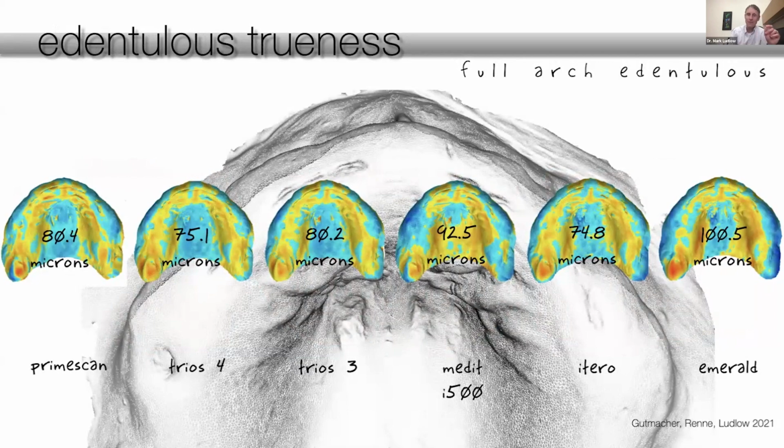The thing that I would say is this, though. While you can, and you can see where the keratinized tissue is, so you can see where your extensions are, what you can't see is how the muscles activate. So you can't see the thickness of the flange. And the other issue that you have is you don't have an ability, unless you make a rim or something to put in there, to figure out where the teeth need to be and how to get the occlusion when it's just two edentulous arches. So when people come in with just two edentulous arches, I snap two alginates, I make a quick custom tray, and I put a bite rim on there. I wash it, then I scan both of those.